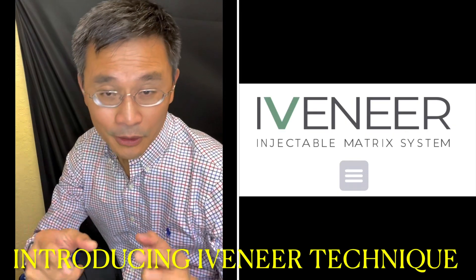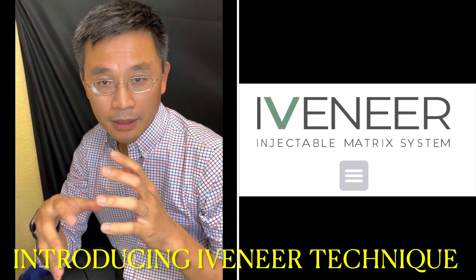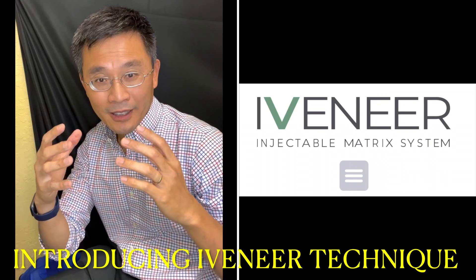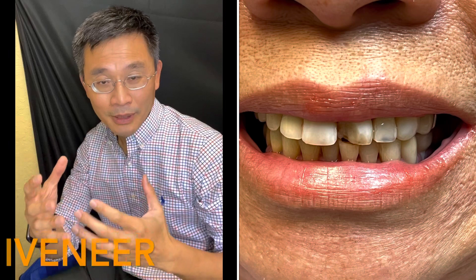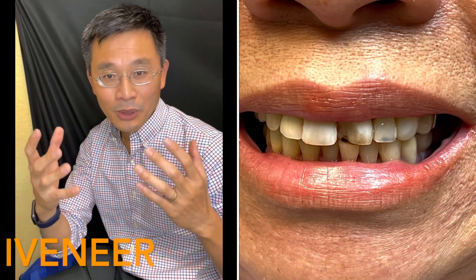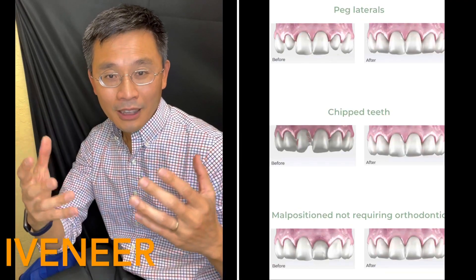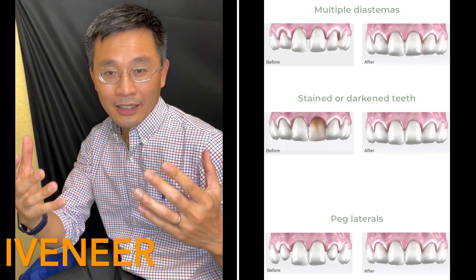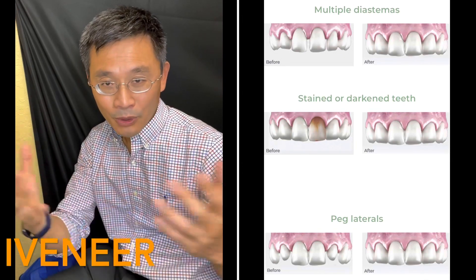In this video I want you to check out a quick four-minute review of how we're changing the patient's smile with a chipped or broken tooth. The traditional way of doing dentistry would be a crown or traditional laboratory veneer, but in this video I will show you that we can accomplish an instant veneer in the office — within 45 minutes the case is done, the patient goes home, no lab, nothing.